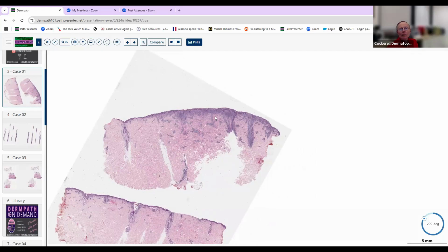Obviously, if it's comprised mostly of lymphocytes, it can be an inflammatory lymphocytic process, a condition that causes a lot of lymphocytes to come into the lesion, or it can be a neoplasm of lymphocytes, like a lymphoma. So you always want to keep that in the back of your mind. You say, well, if this was an inflammatory process and they took an incisional biopsy that almost looks like an excision of a melanoma, maybe it's not just an inflammatory process. Maybe it's a hematolymphoid lesion.